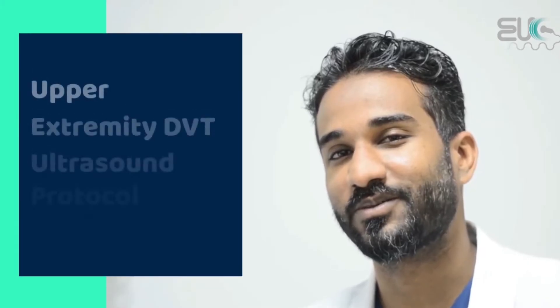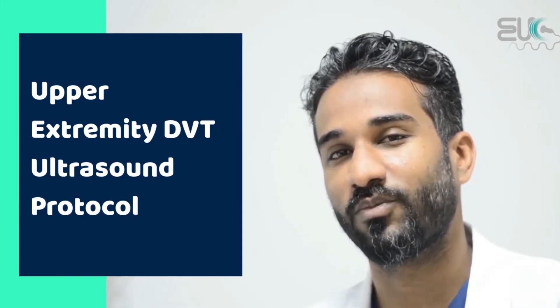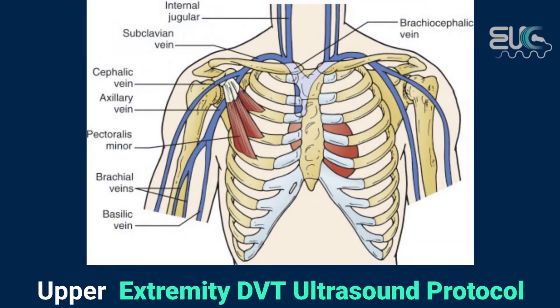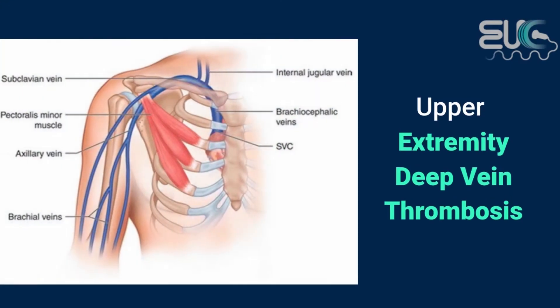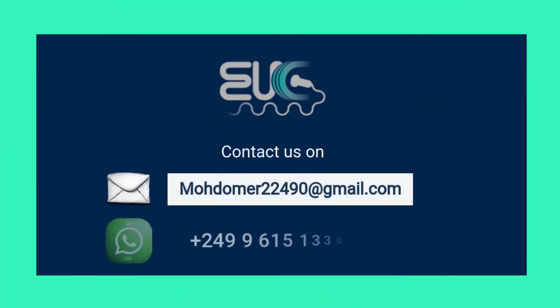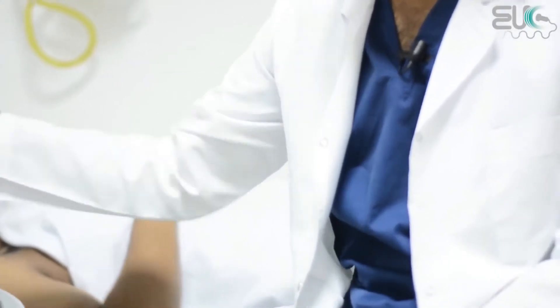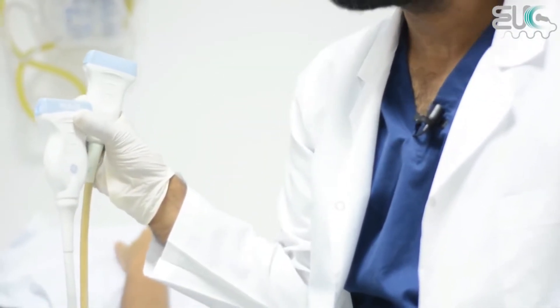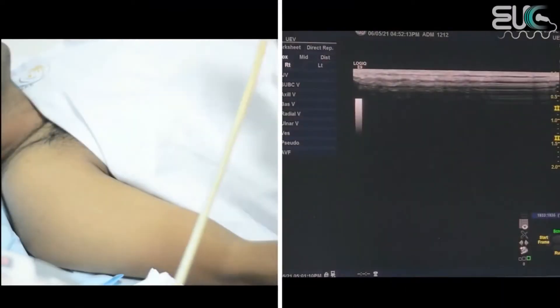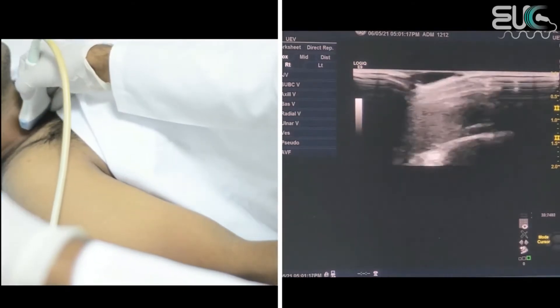Hi everyone, this is Mohamed Omer, medical diagnostic sonographer. In this video, I will show you how to scan a patient for upper extremity venous thrombosis. I will start with a linear probe at 9 megahertz, and I can also shift to 15 megahertz for superficial vessels. I will start with the internal jugular vein by putting the probe at the anterior neck.